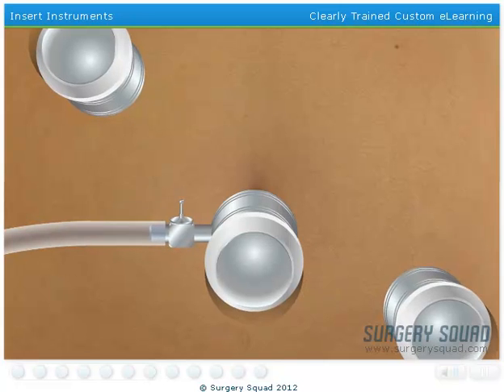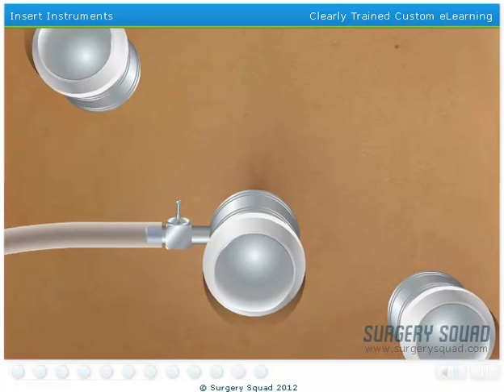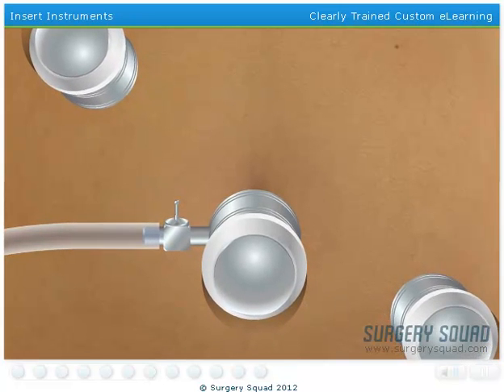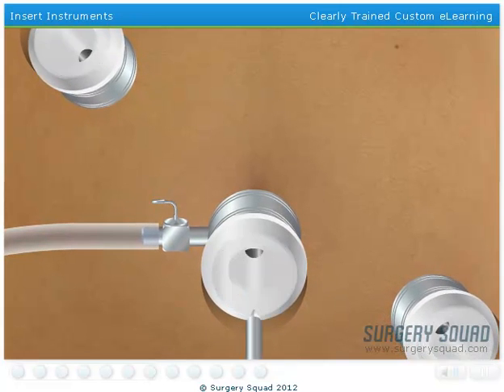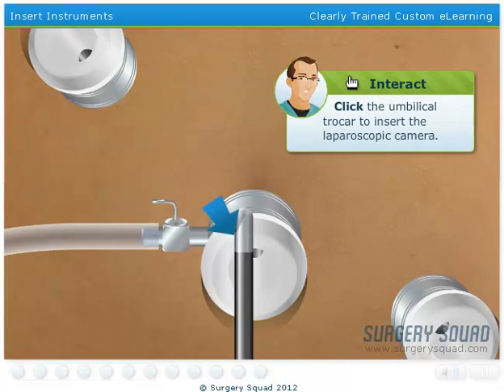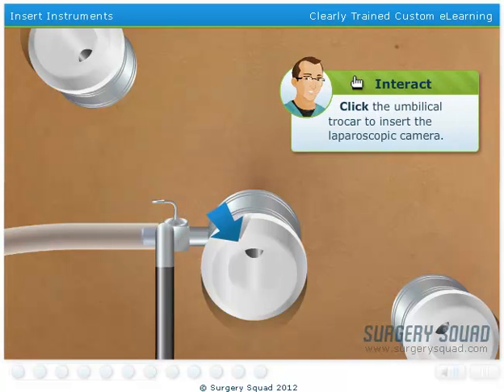Next, we need to insert our laparoscopic camera through the umbilical trocar. Images from the camera are projected on our monitor to allow us to inspect our patient's abdomen and confirm that the appendix is infected.